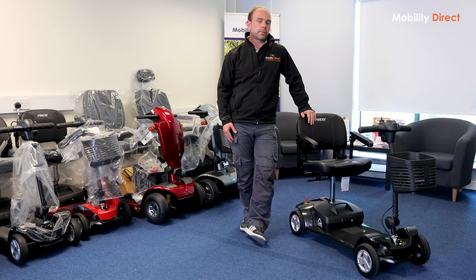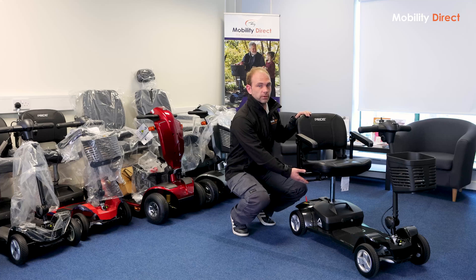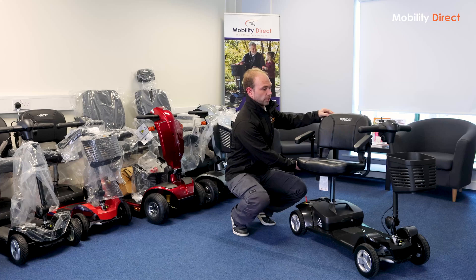In terms of operating the scooter, it works exactly like the older Apex Light model and very similar to most small scooters from Pride. So the first thing you want to do is obviously get into the scooter. Most scooters from Pride will have the swivel function — there's usually a lever on the right-hand side of the seat that you can lift up and turn the seat any way you like.